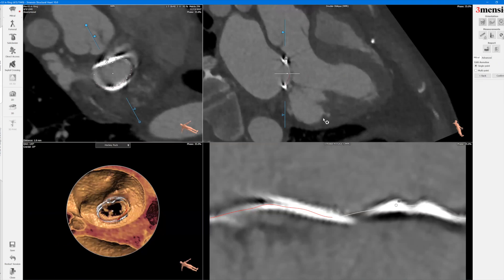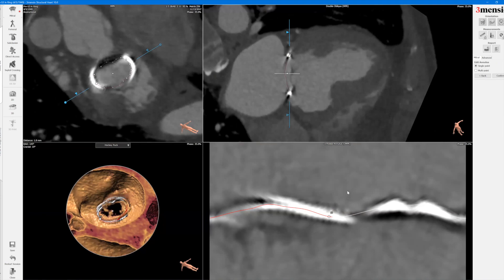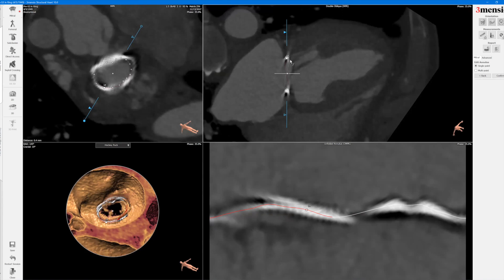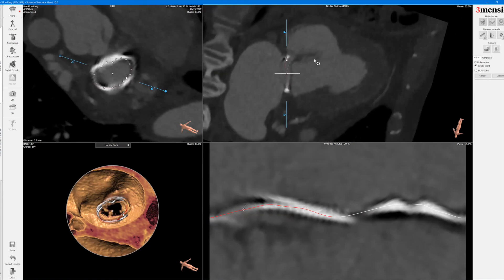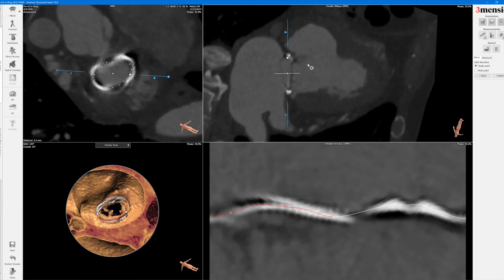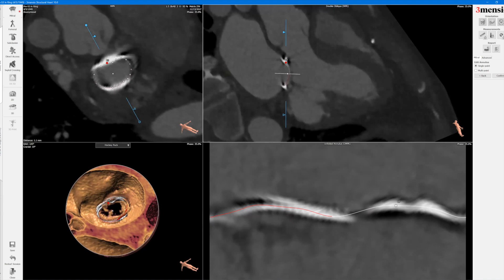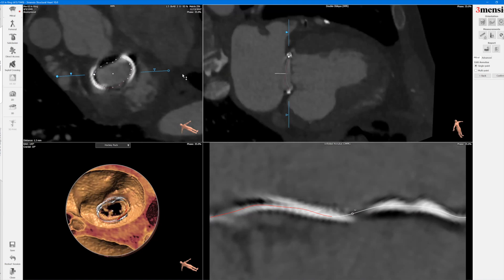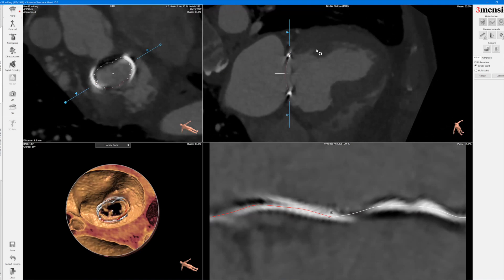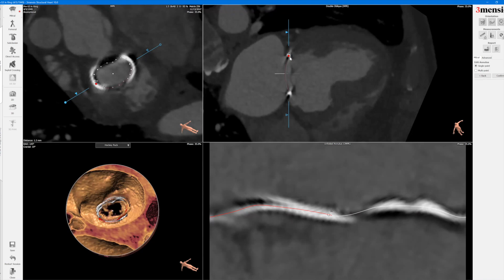Most rings are saddle-shaped — that's how they're designed to kind of freeze the mitral annulus in a certain part of the cardiac cycle. You need to make sure that your plane is along the annuloplasty at the same height so it gets projected to a certain dimension. You put it into a certain red line relative to the plane here. You can certainly add more lines and you can see this is indeed a saddle-shaped structure.